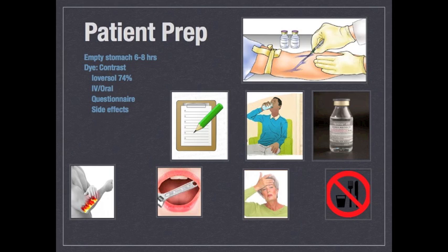After, we proceed to place the intravenous entrance for the dye and ask the patient to slowly drink the solution, allowing the contrast to highlight the structures properly. Here, we can mix the dye in flavored water for the patient's benefit. After drinking about 4 to 8 cups of contrast mixed with water, we then proceed to the next phase.